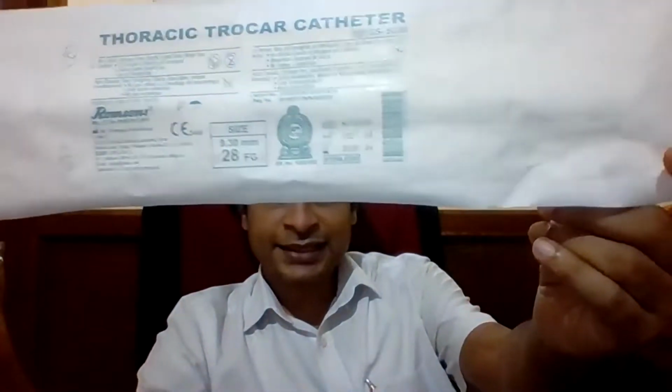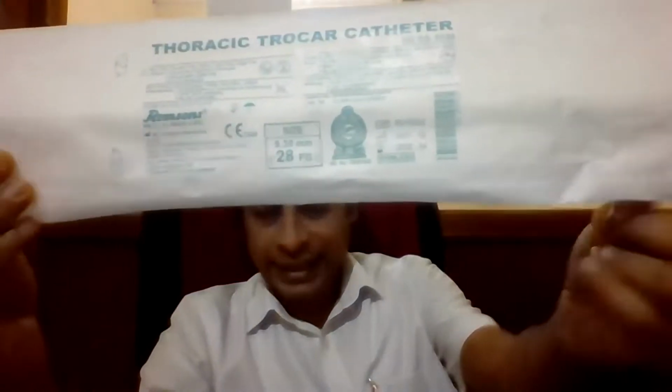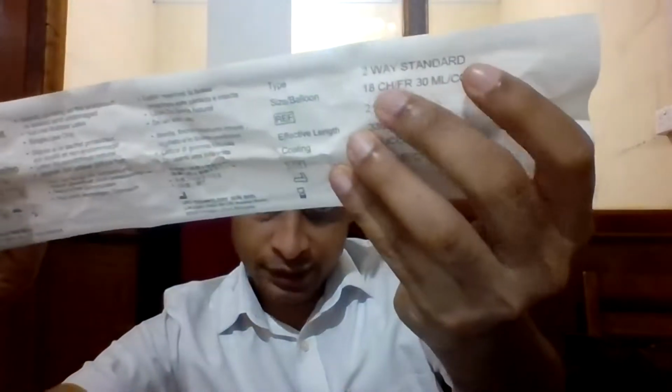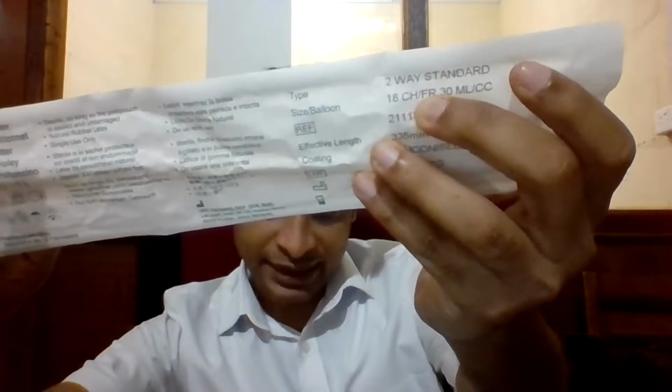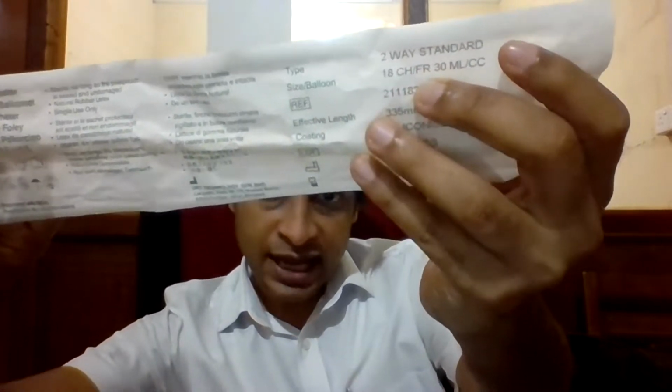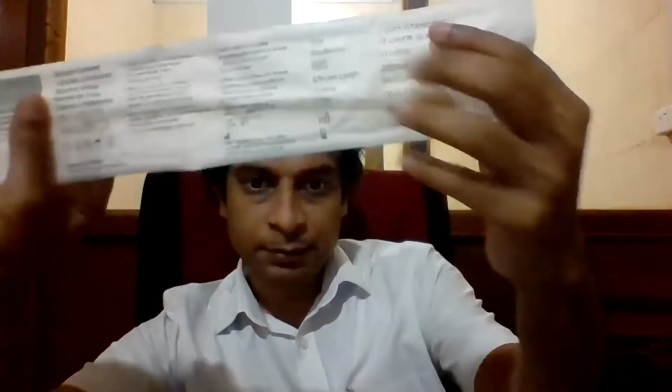FG stands for French gauge. Things like chest drain tubes, right? And then another type of tube that I'm going to show you later on, which is a catheter tube, right? As you can see here, it says 18 CH FR. The FR again stands for French gauge. Some types of tubes are sized according to French gauge.